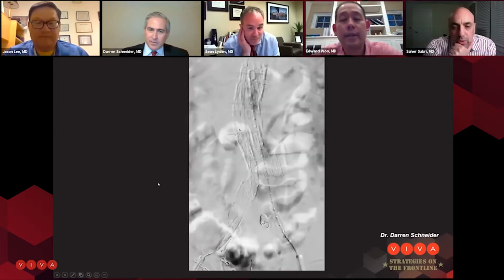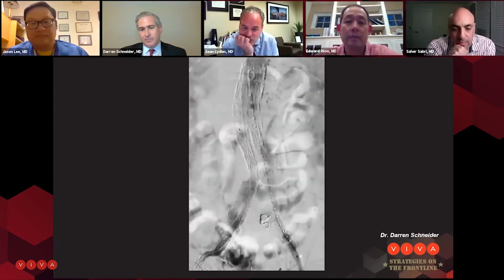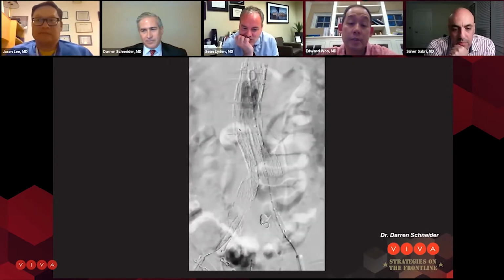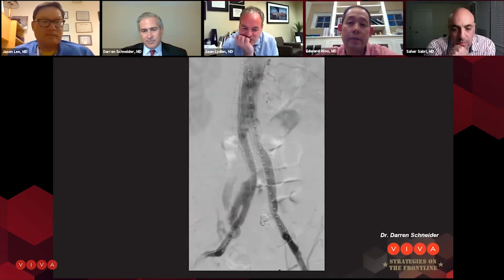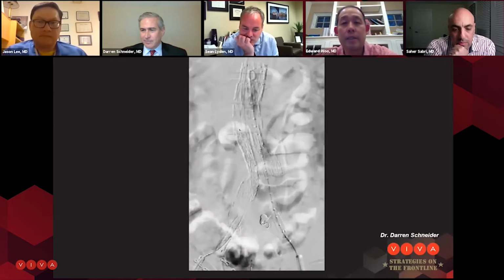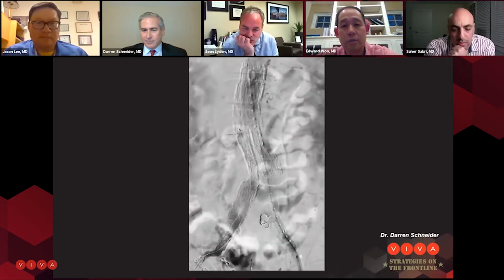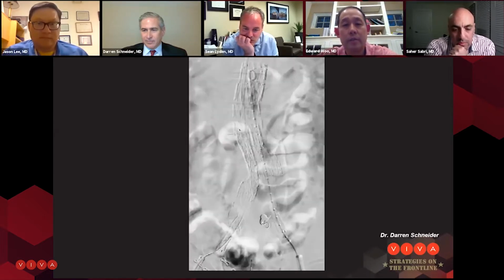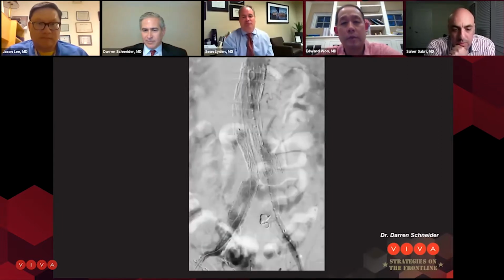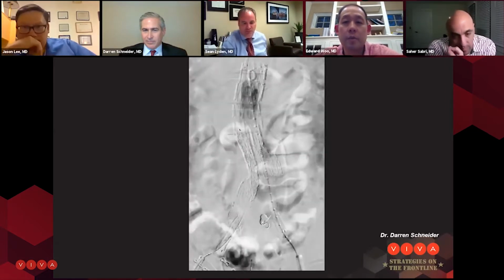Sean, to kind of answer your question, I had a patient exactly like this. Prior EVAR, bilateral commons, I coil embolized one side, took it down, and then instead of doing this with an IBE, I did a retroperitoneal incision and did an external to internal iliac artery bypass and then extended down. The reason I did that was because there was a lot of tortuosity in that internal iliac artery, and I was concerned about long-term durability of a stent in place. So there's kind of the in-between, without totally explanting the whole EVAR device, doing some combined open endo approach.